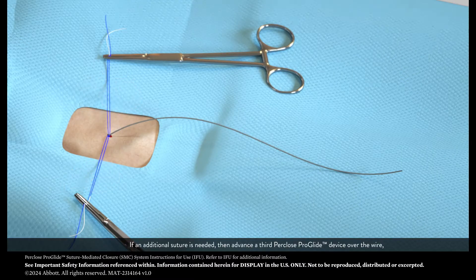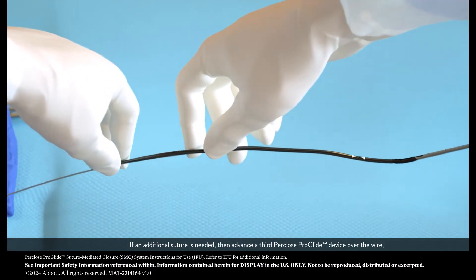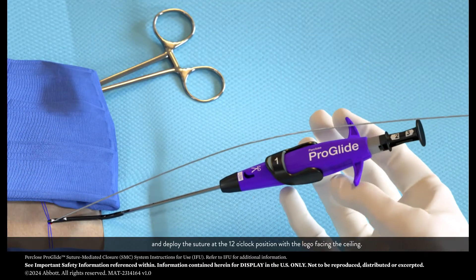If an additional suture is needed, then advance a third per-close ProGlide device over the wire and deploy the suture at the 12 o'clock position with the logo facing the ceiling.